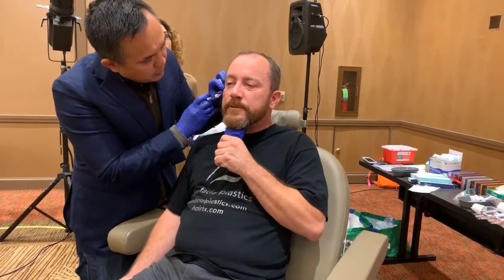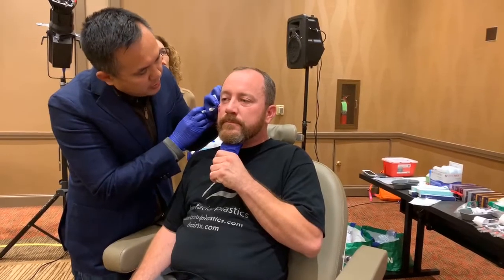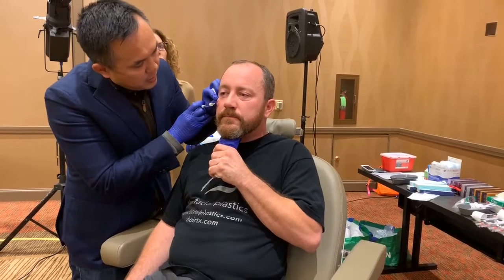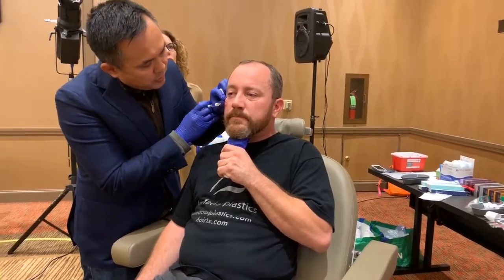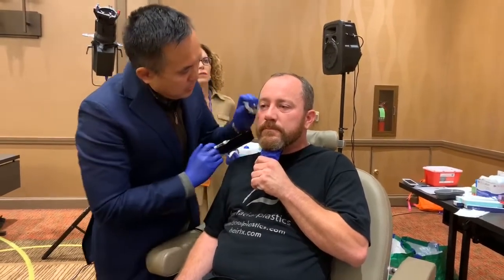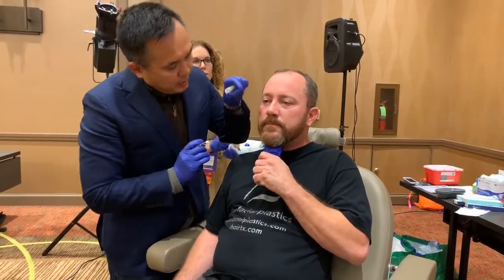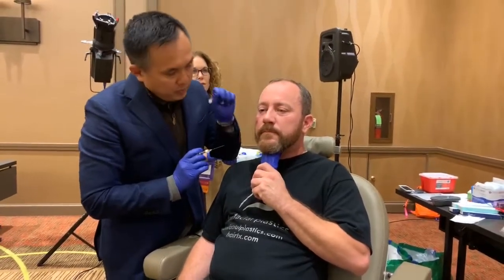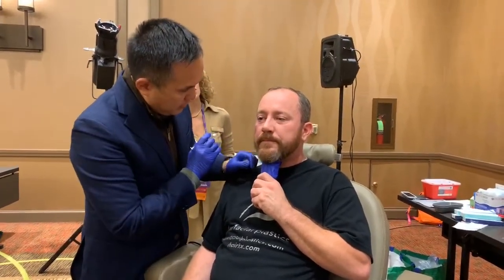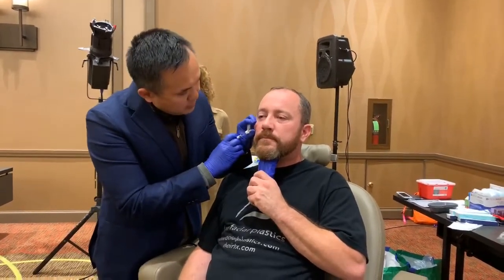Gently filling this area. The discomfort for the patient is twofold: one is entry. It's better in my opinion to use a larger gauge needle so they don't feel it, because the dermis is where the discomfort level is. I strongly believe in using at least a 22 gauge. The trick is if you make the little site and you can't get in there, stop and remake the hole — because digging around to get into the hole is where the discomfort is.